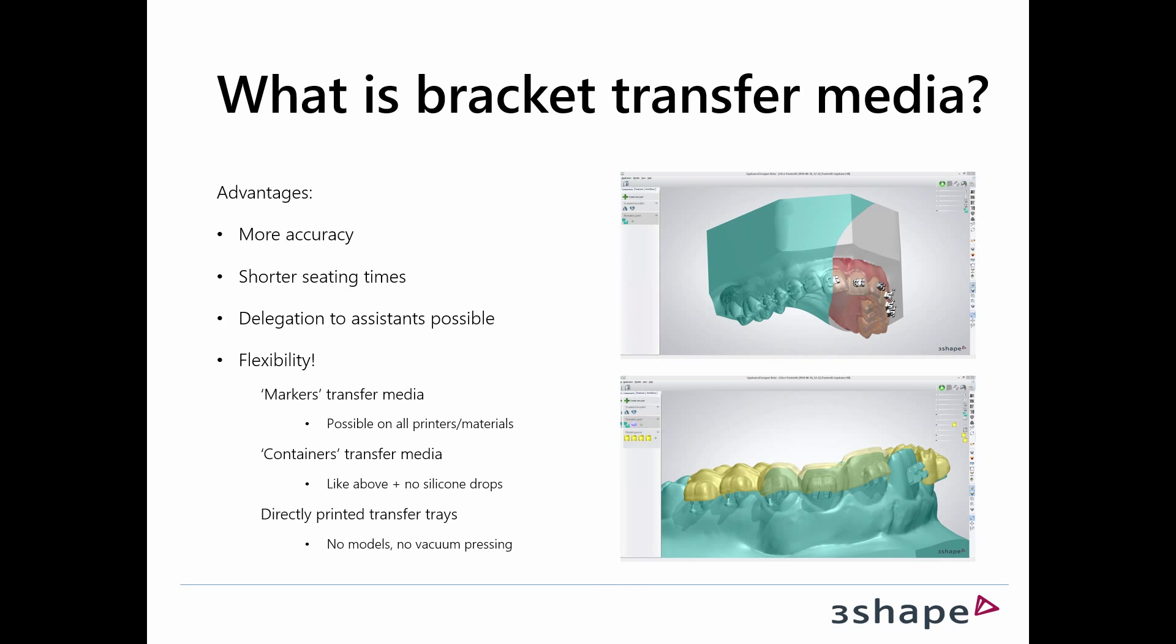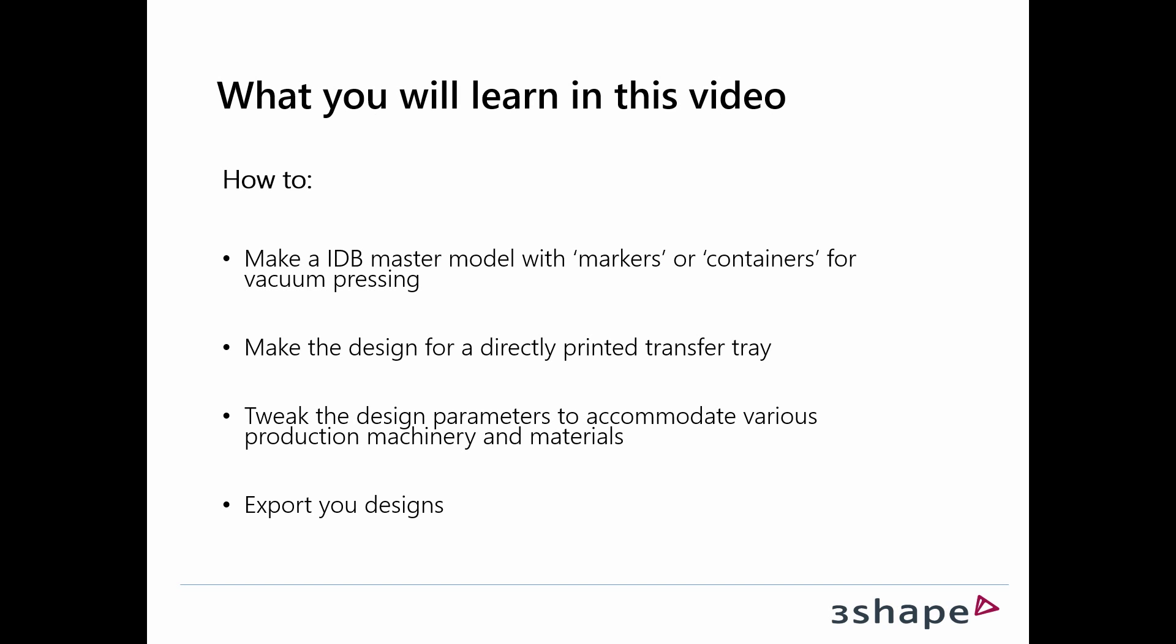You will learn to make these traditional models that you use as a basis for your vacuum pressing, and we will learn how to make a directly printed transfer tray that would circumvent these previously mentioned elements. We will also look at what possibilities we have to adjust the designs to meet the requirements from various machinery and materials.